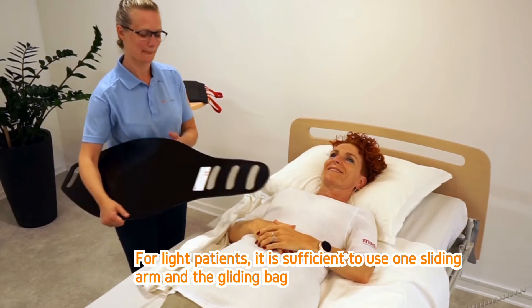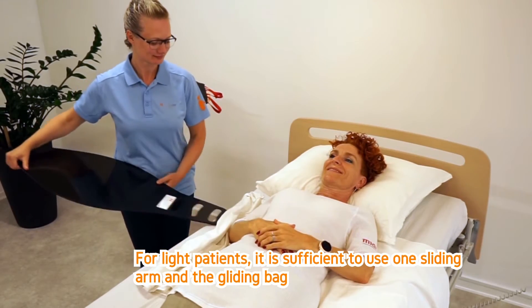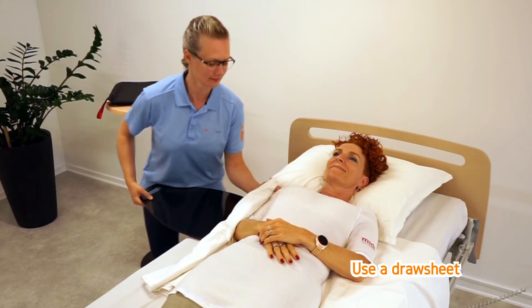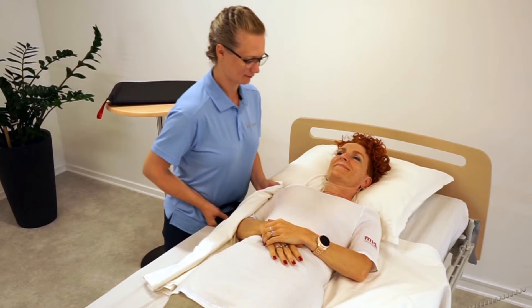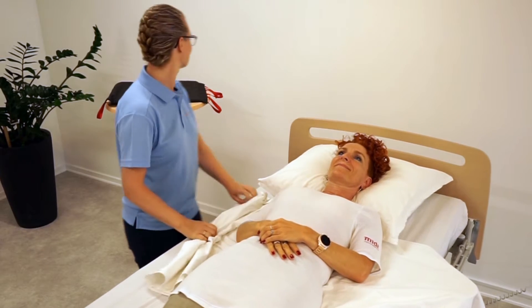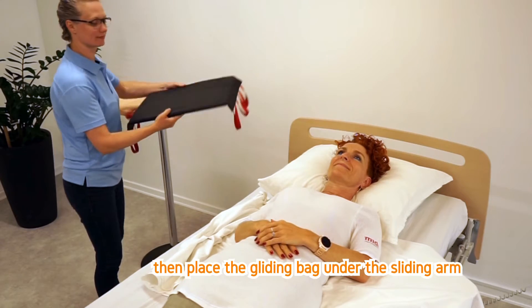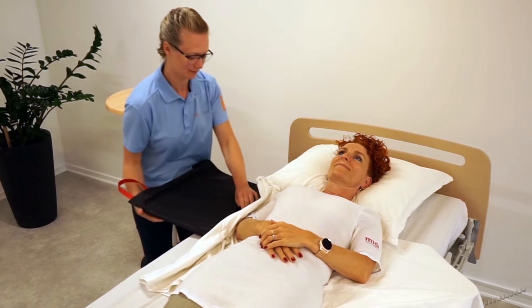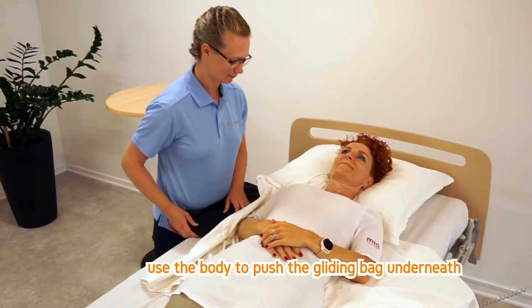For light patients, it's sufficient to use one sliding arm and a gliding bag. Use a draw sheet. Push with your body. Then place the gliding bag under the sliding arm, using the body to push the gliding bag underneath.